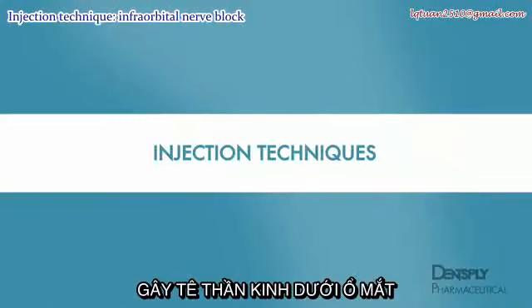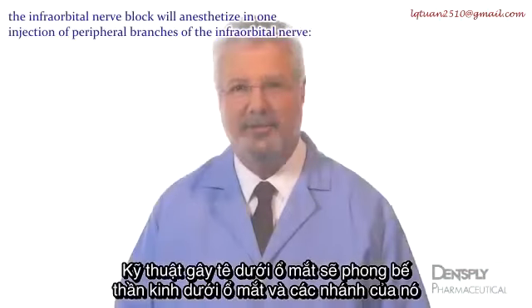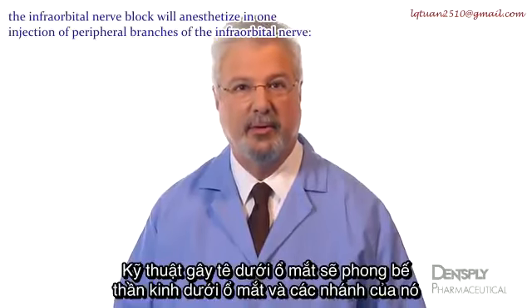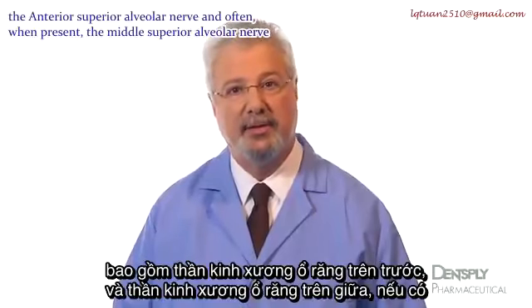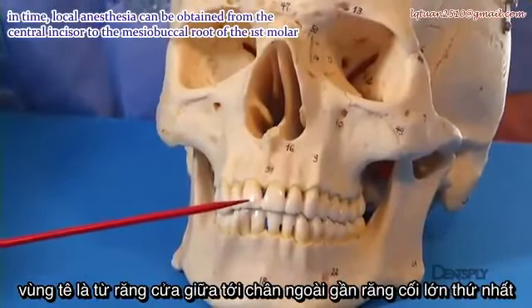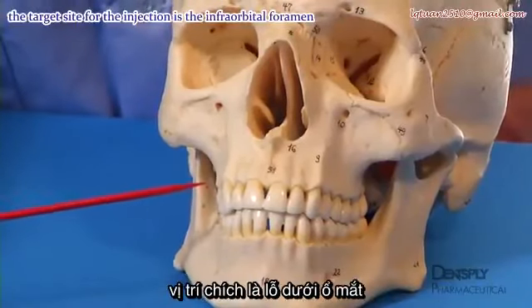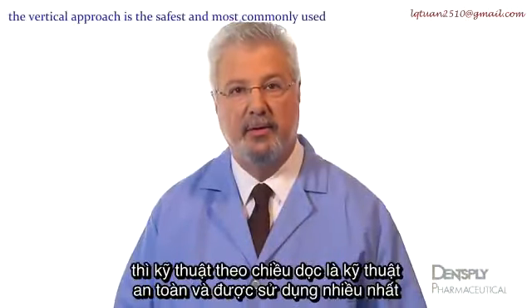Injection techniques. Infraorbital nerve block. The infraorbital nerve block will anesthetize in one injection all peripheral branches of the infraorbital nerve, the anterior superior alveolar nerve, and often, when present, the middle superior alveolar nerve. At times, local anesthesia can be obtained from the central incisor to the mesiobuccal root of the first molar. The target site for the injection is the infraorbital foramen. Although several approaches have been described, the vertical approach is the safest and most commonly used.